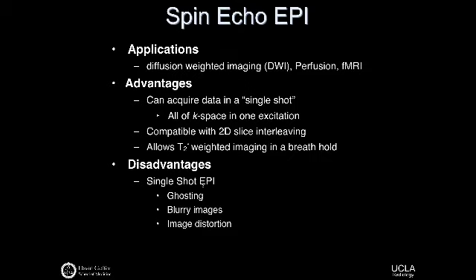They're sensitive to sort of ghosting artifacts, having blurry images, and in fact, image distortion. So scanning as fast as we possibly can usually doesn't give us the best image quality. So again, there's trade-offs between how fast we need to scan and the image quality that we need.